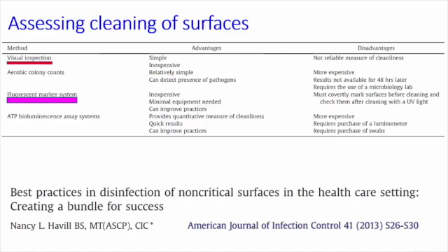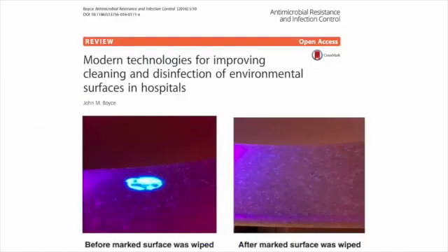And so we've written some articles about this in the ADA News Bulletin over the years. There are also techniques such as ATP bioluminescence, which require you to buy quite an expensive luminometer and some special swabs to go with it. And it only gives you part of the story because you're only picking up the viable bacteria. Now, the idea of using a fluorescence tracer has been in the literature for quite a long period of time.